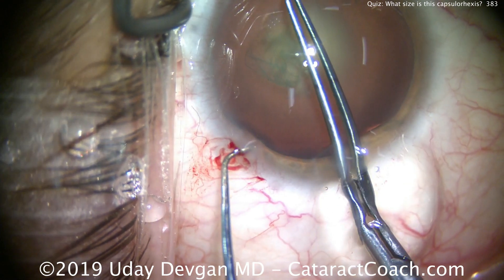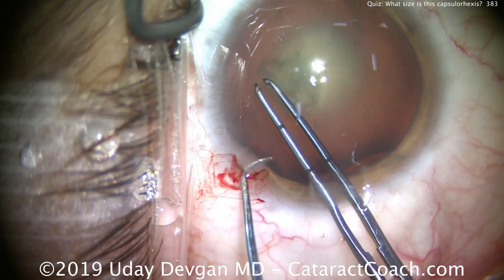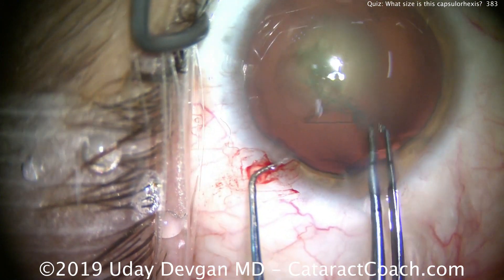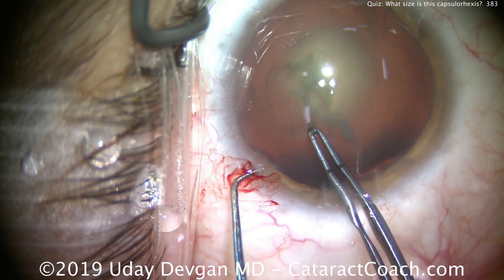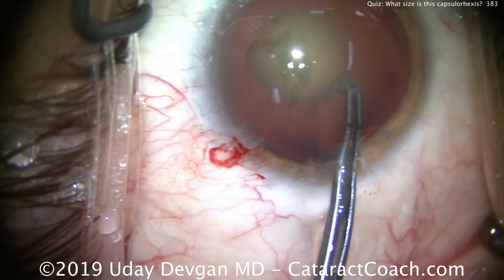We're going to create our capsulorhexis here in the anterior lens capsule, trying to keep our rhexis centered on that Purkinje light reflex. We'll continue this rhexis here, grabbing with the forceps, pivoting.